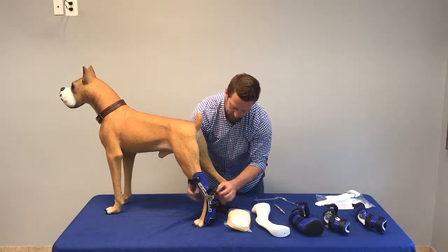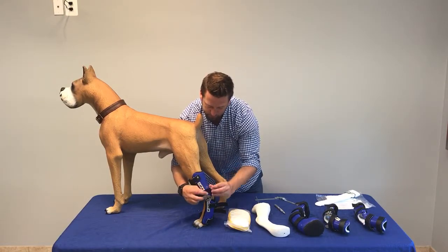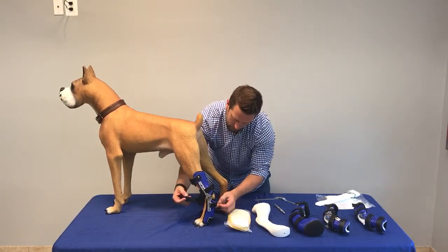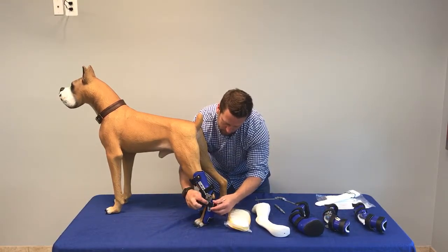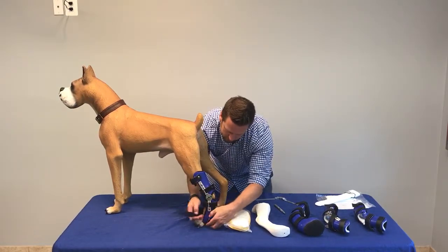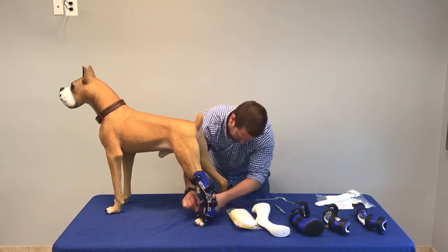You can fit these braces while standing up or laying down, whatever your dog wants to do. Once you fit this, what I like to do is take a silver Sharpie and mark the straps for tightness, so you can consistently tighten it over and over again the same way.